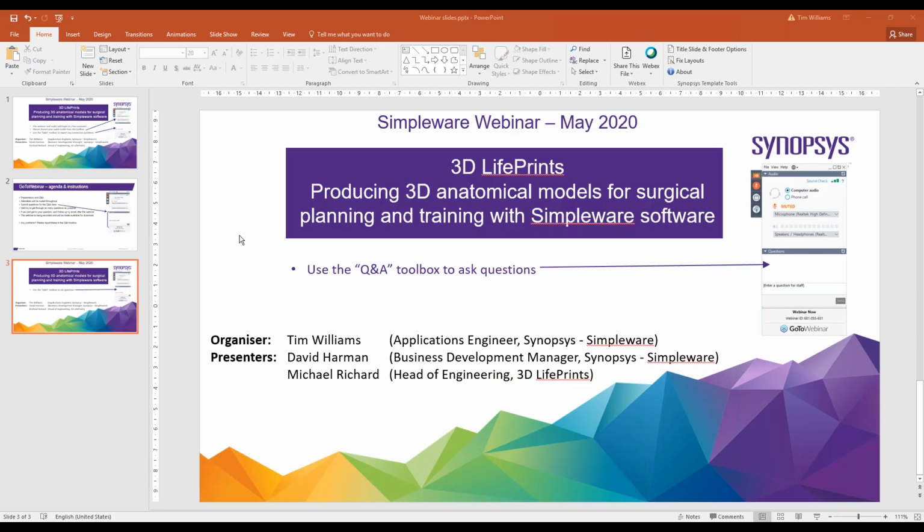Yeah, sure can. So in each of our contracts that we have with NHS trusts around the country, the contracts are completely unique to the needs of the exact center. Up in Liverpool, we produce hundreds of pediatric models in a variety of materials, ranging from cutting edge soft tissue mimicking materials.